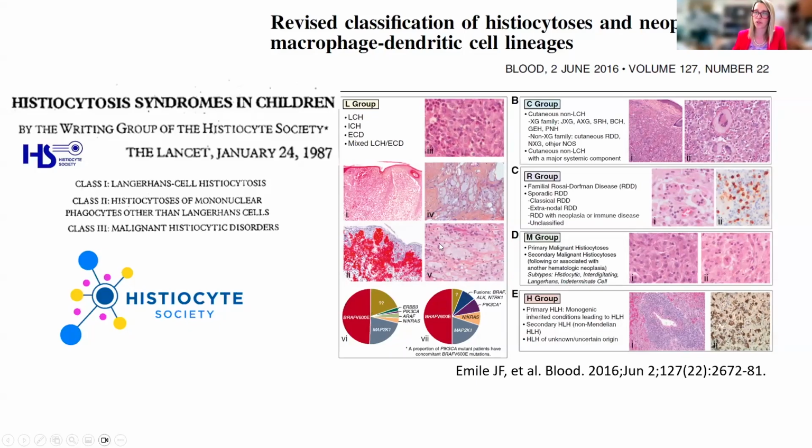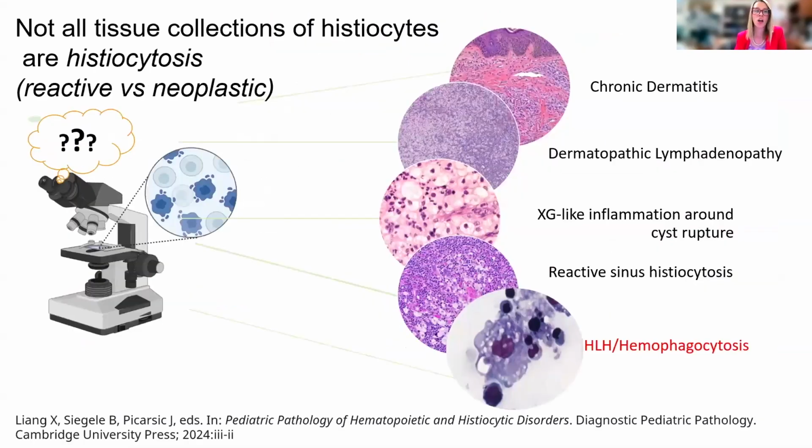We'll highlight a few of those cases upcoming. And then in the M group, again, to understand that once you hit that threshold of malignancy, it's within a different category as compared to these others. And the main point is to get it into this category rather than trying to always subclassify the type.